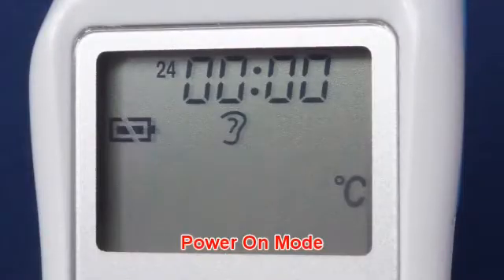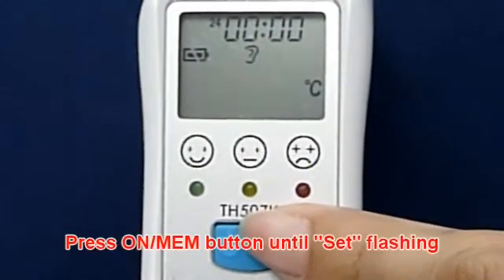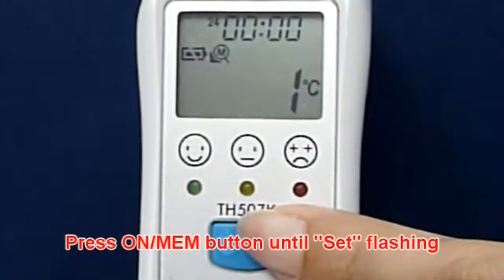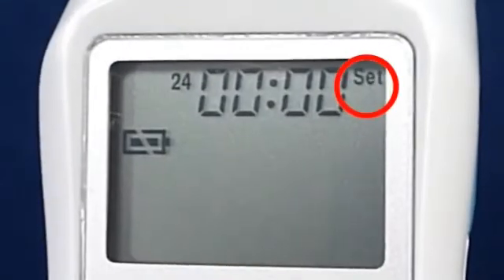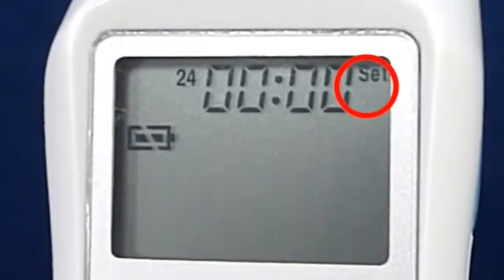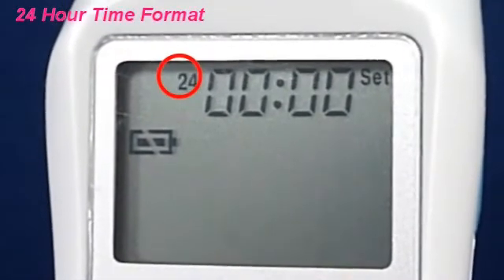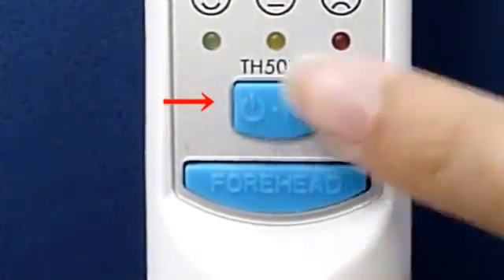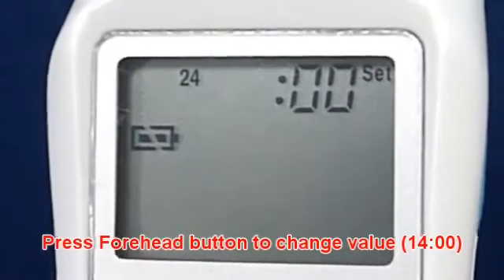In Power On Mode: press the On Memory Button until 'set' is flashing. Press the Forehead Button to select 24-hour time format. Press the On Memory Button to set the hour, then press the Forehead Button to change the value.